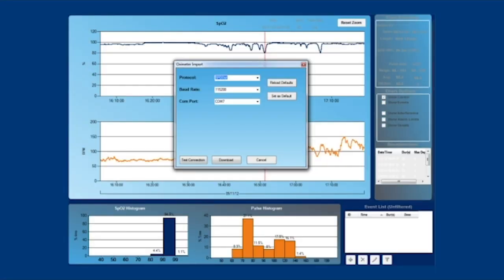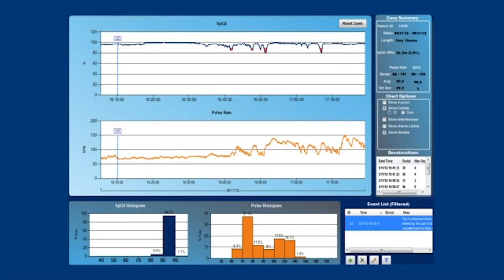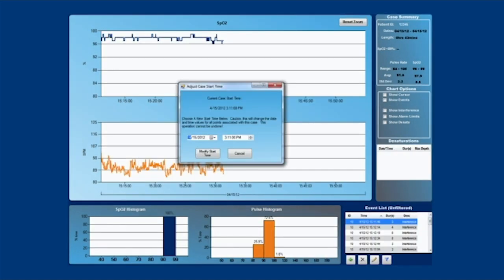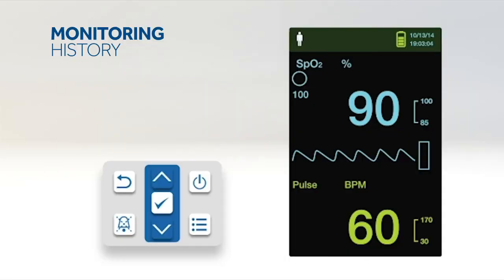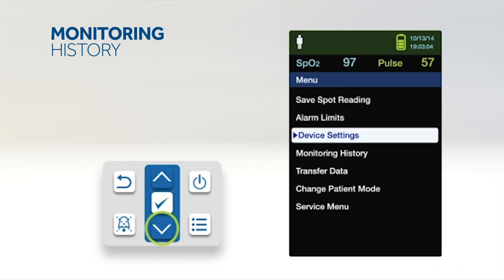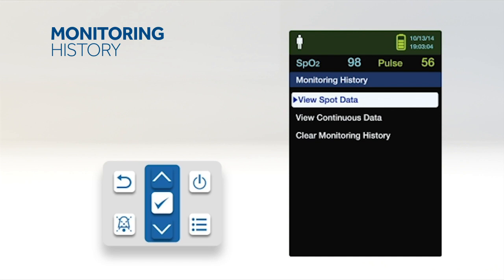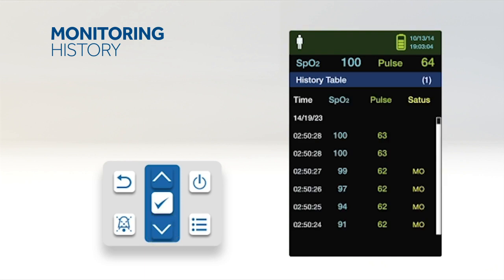The monitoring system supports wired data exports to an external PC for data analysis and printing, and offers up to 80 hours of data storage capability. The PM10N presents trend information in tabular format with the newest data values at the top. To review monitoring history, press the menu button, press up or down to highlight monitoring history, then press OK. From the monitoring history menu, select view spot data or view continuous data. Use the down arrow to scroll, and press OK to adjust the display interval to every one, five, 100, or 500 data points.